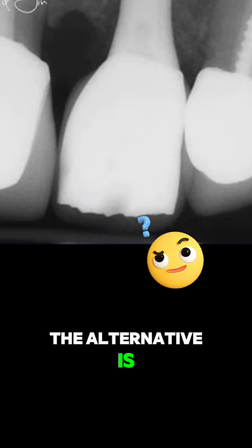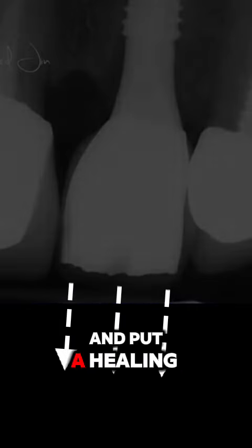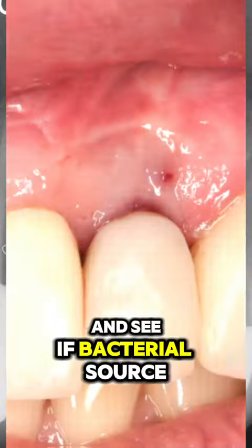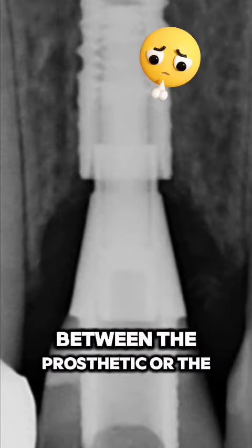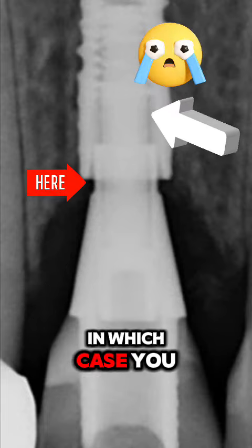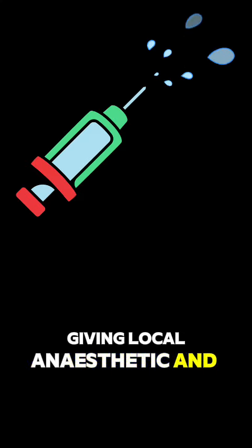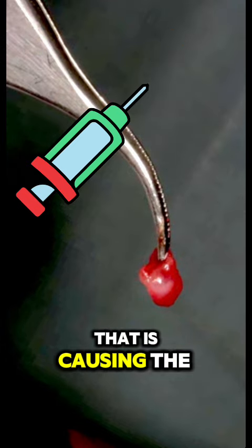The alternative is you can also remove the existing abutment and put a healing abutment and just let the area sit for a while and see if the bacterial source is gone. Sometimes some tissue can actually get stuck in the way between the prosthetic or the healing abutment and the implant platform itself, in which case you need to actually spend time giving local anesthetic and basically incising out that piece of tissue that is causing the problem.